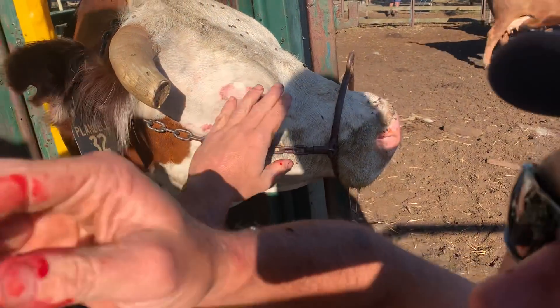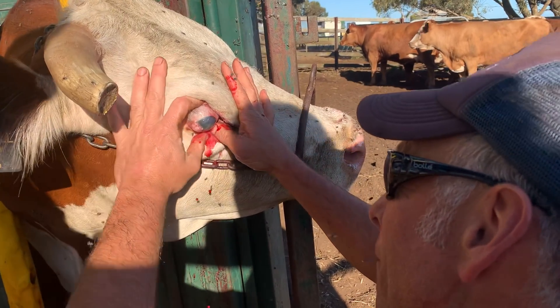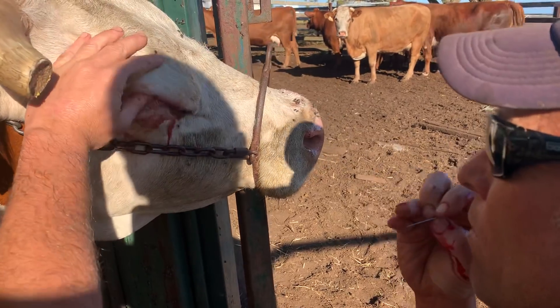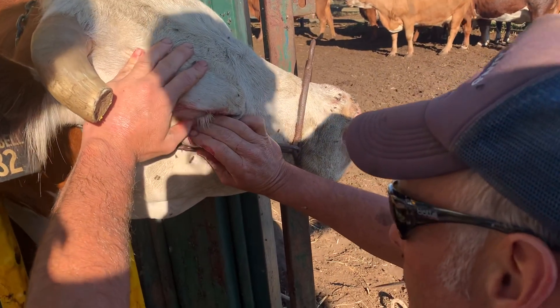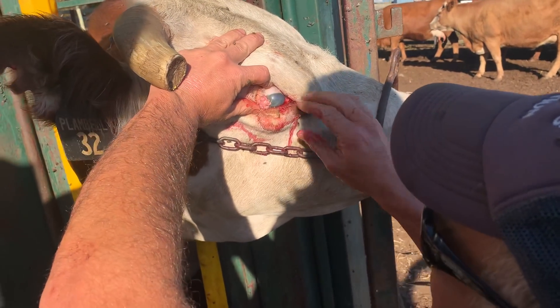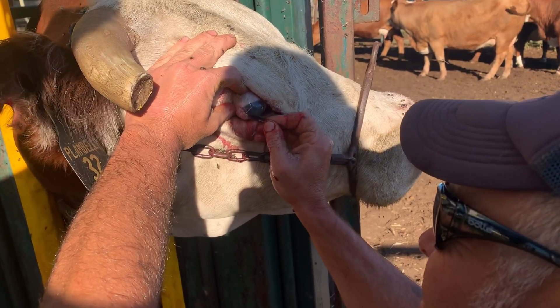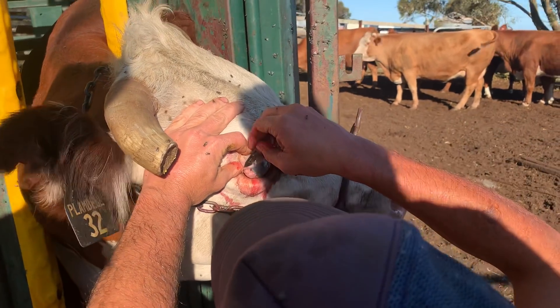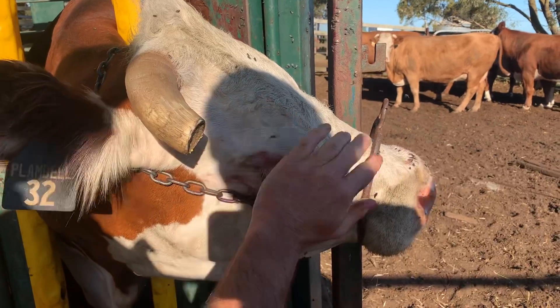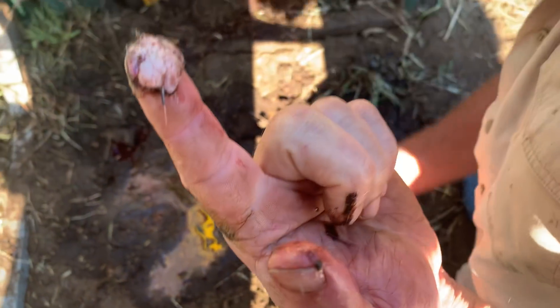That was pretty cool, huh? She popped her back in. Can't see it — a little bit of cancer. Dropped in the mud. In veterinary world, we call this mud — we all know what it really is.